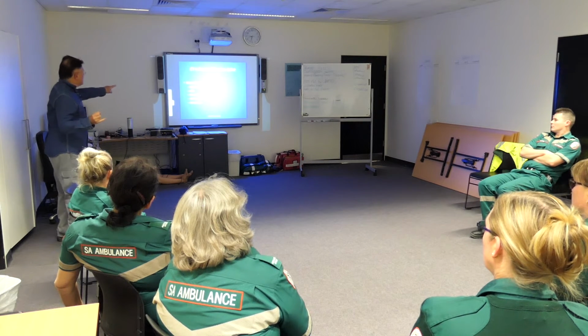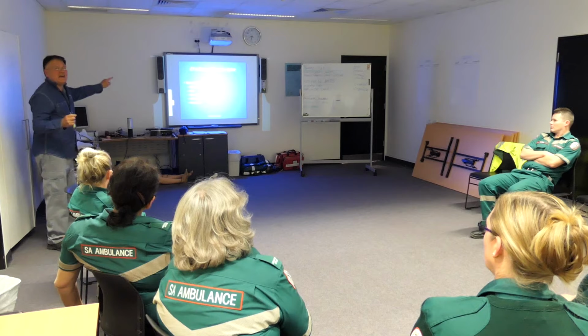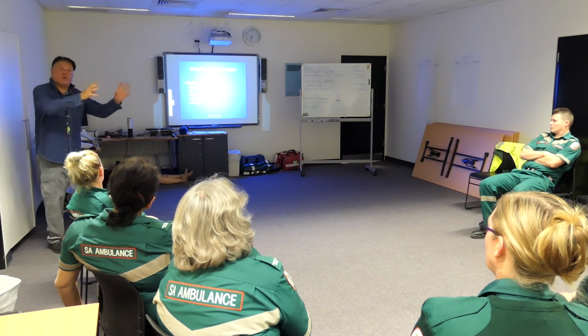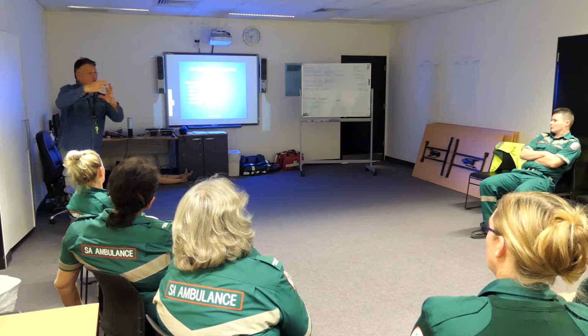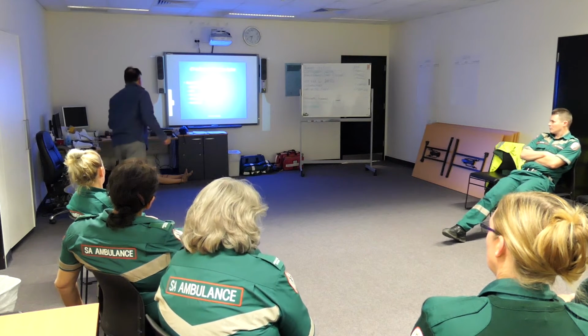So if you have a foot injury, ankle injury, or a knee injury, even though they have a femur fracture, you can't use it. If they have a neck of femur fracture, which is all the way up on top of the femur next to the pelvis where it actually sockets into the pelvis, they don't want you to, because the orthopedist doesn't want you to pull. They want you to leave it in that position. So for that problem, the CT6 won't work. It'll make the problem worse, and the pelvic fracture we just talked about.